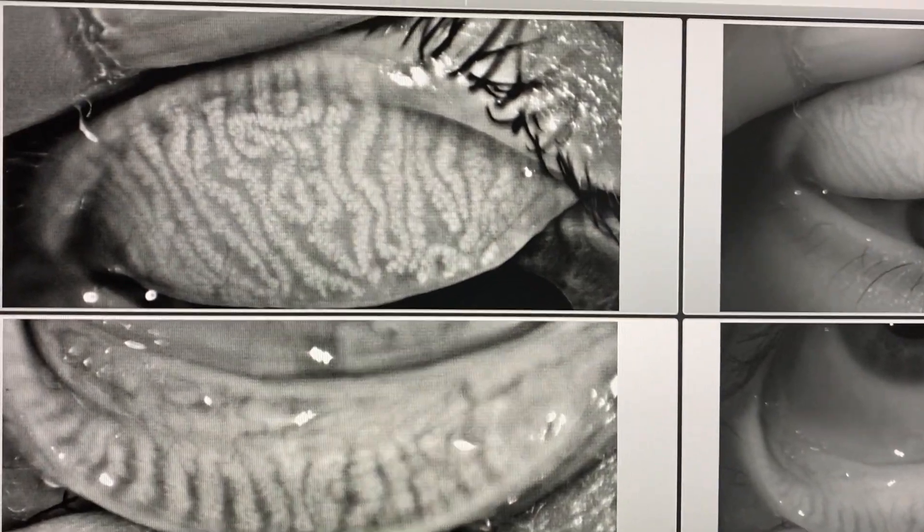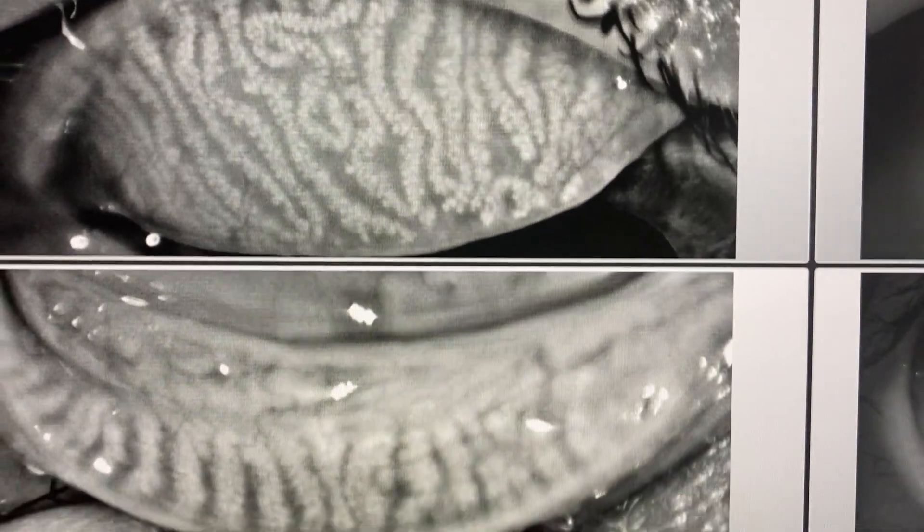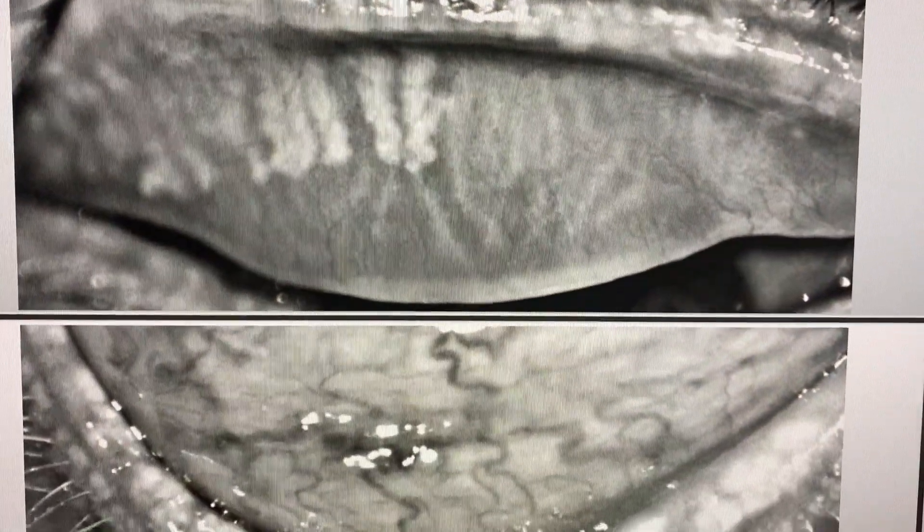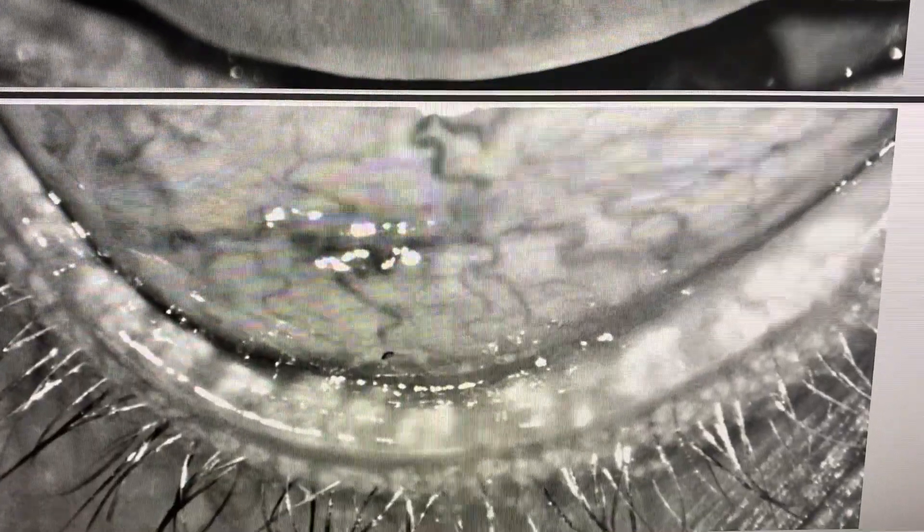Number one: meibography. Infrared lighting helps us view the meibomian glands — the oil glands — in the upper and lower lids or tarsals, which are responsible for the oily lipid layer that helps prevent evaporation of the tear film. According to a study by Lemp et al., 86% of dry eye cases are a result of meibomian gland dysfunction. The Keratograph 5M has baseline photos ranging from basically healthy glands all the way to severe dropout, allowing us to match exactly where the patient's glands are. It really gives that shock factor to the patient.